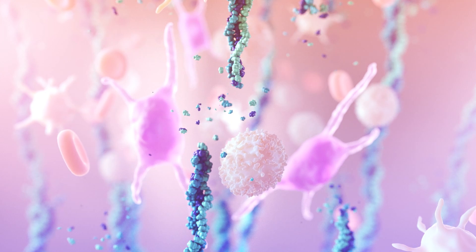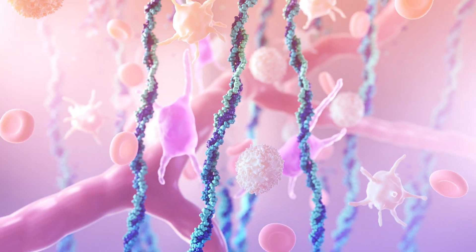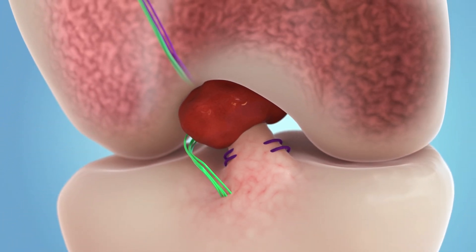Over time, the implant is absorbed and replaced with native cells, collagen and blood vessels, allowing the torn ends of the ACL to heal back together.